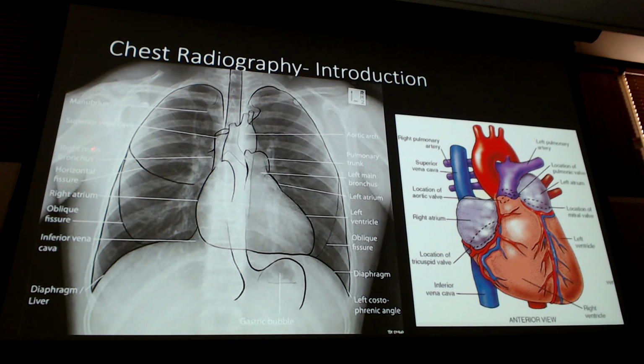Here I have soft tissue, bone in the ribs, lung tissue, and heart tissue, which is thicker and more dense than the lung tissue, right? I have the diaphragm area and the trachea. There are a lot of different densities going on in the chest x-ray, which means there are a lot of things that need to happen for us to say this is adequate enough for me to try to make a diagnosis.